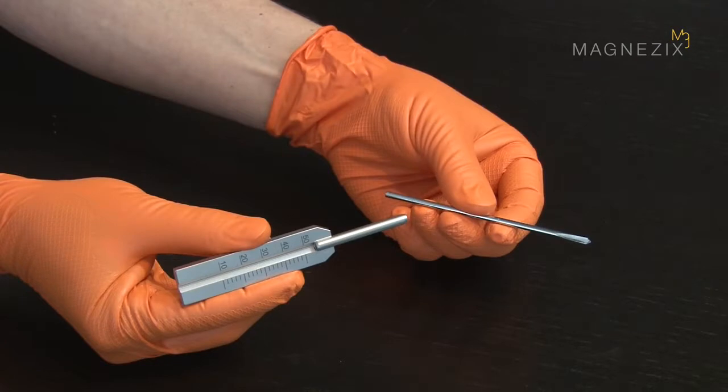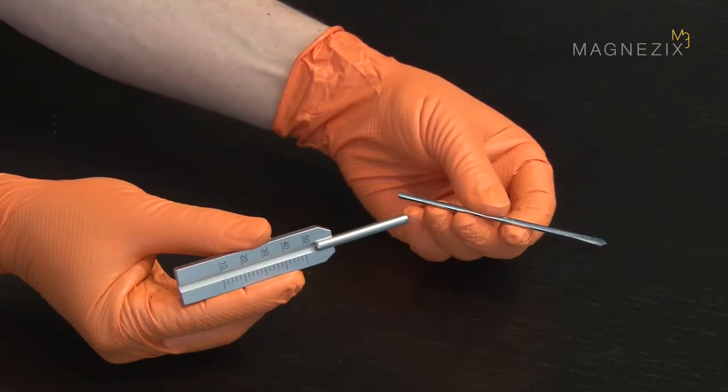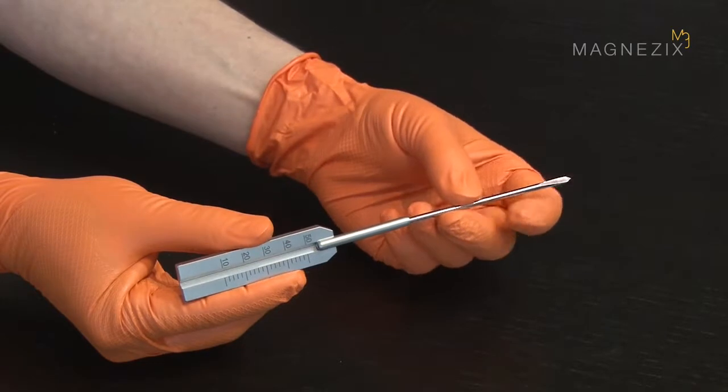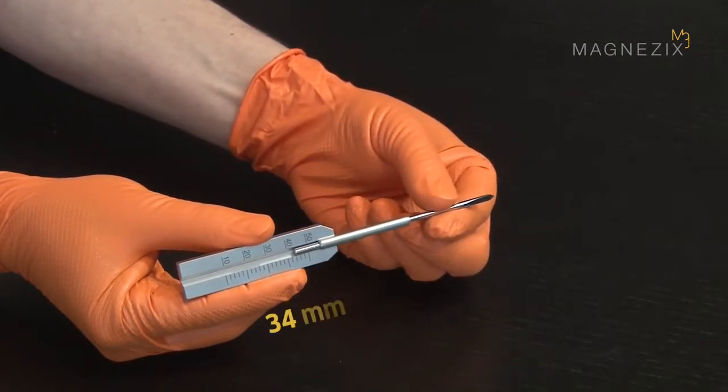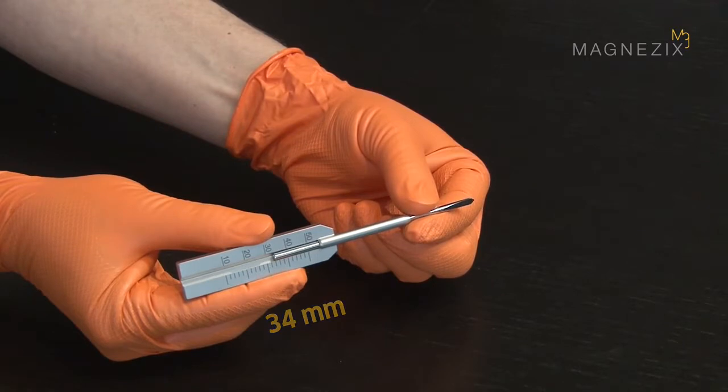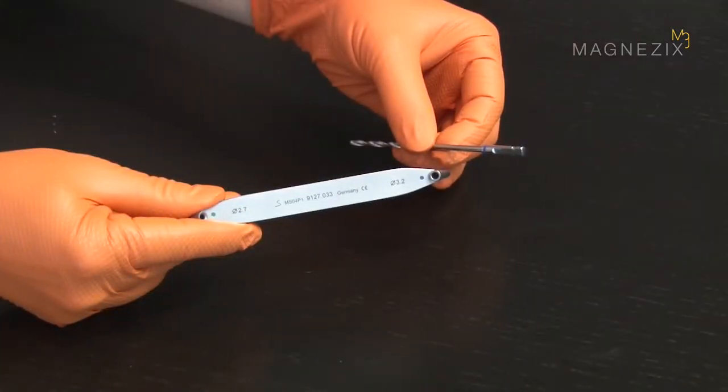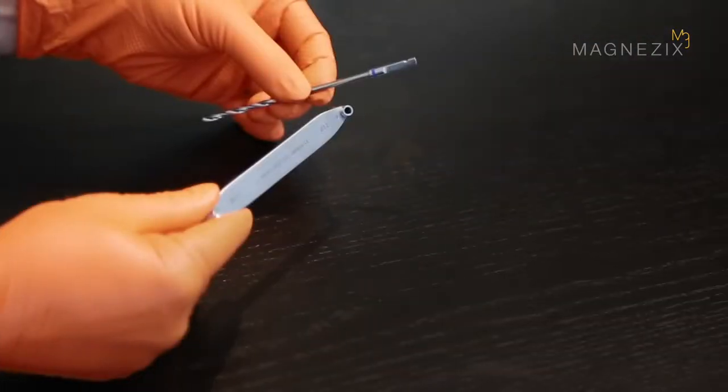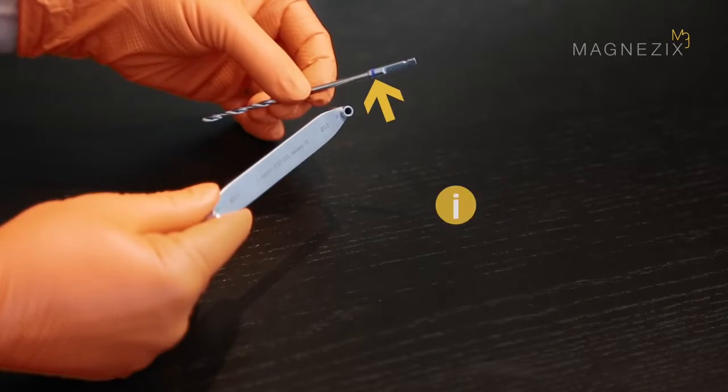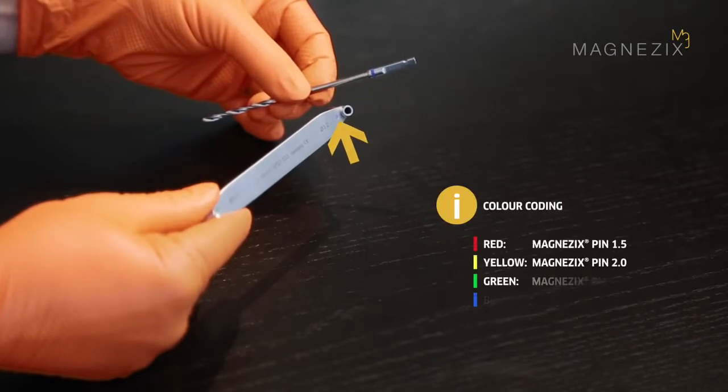If the reduction wire has been used for temporarily stabilizing the fracture situation, the length of the pin can be determined by advancing the measuring device over the reduction wire up to the bone. All instruments compatible with the different dimensions are color coded to ensure the correct instrument is used for each pin dimension.